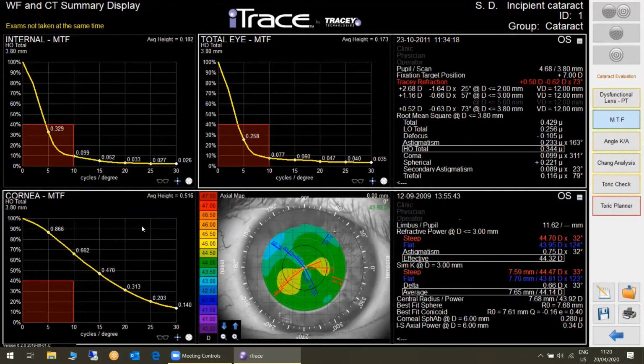Is with a map against the wall, with the lines, and they're getting smaller and closer to each other and different color. How do I read this display? From 0 to 100%, I have my contrast. 100% contrast, it means if I close my eyes or I open them, the difference between black and white is 100% contrast.